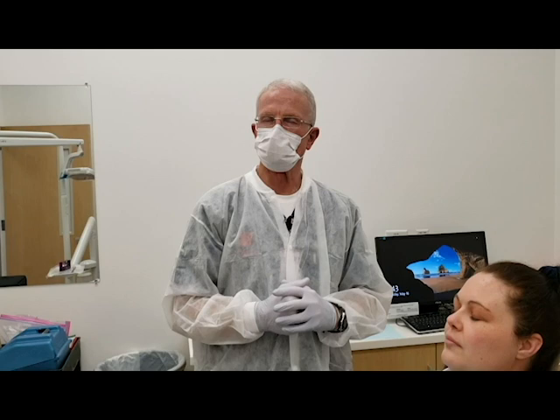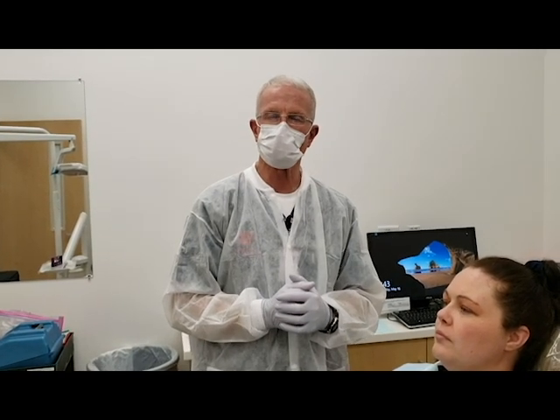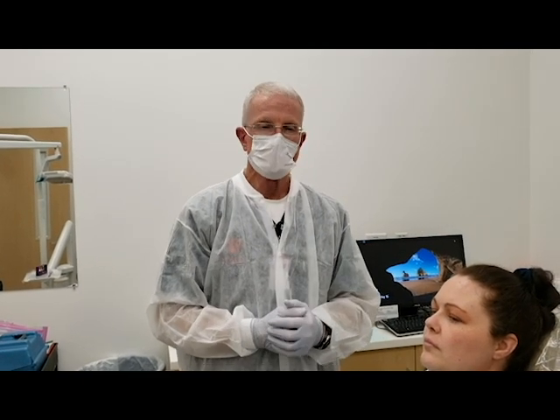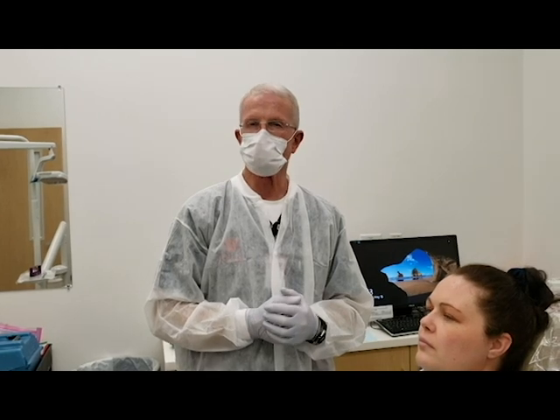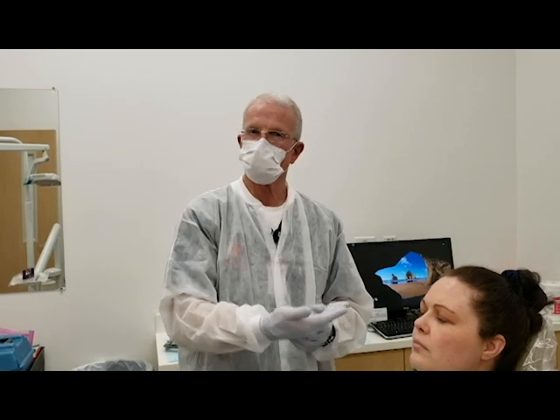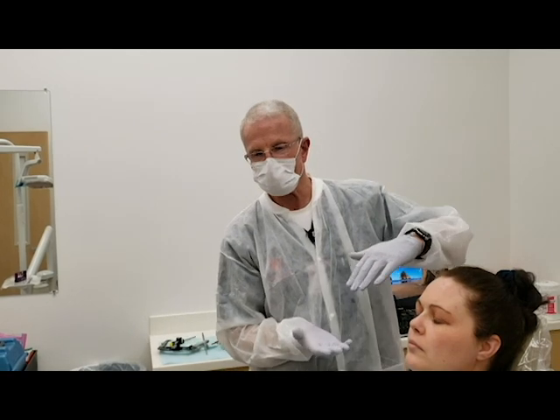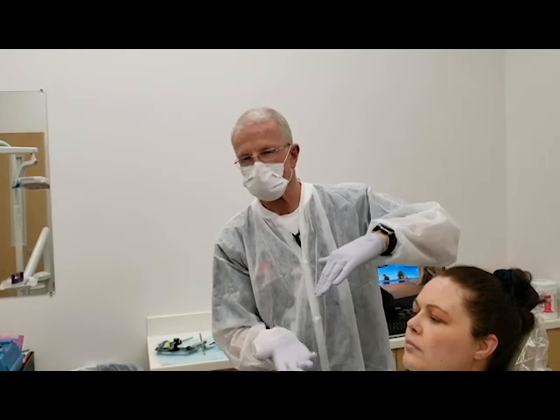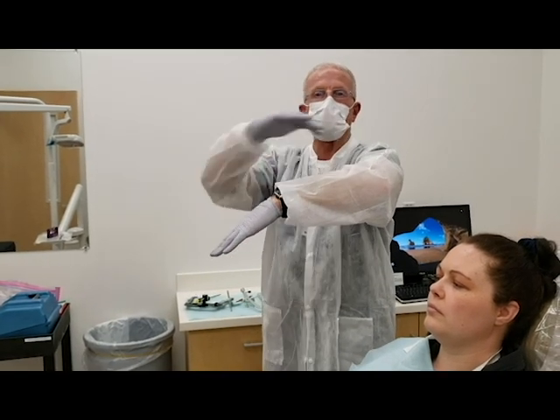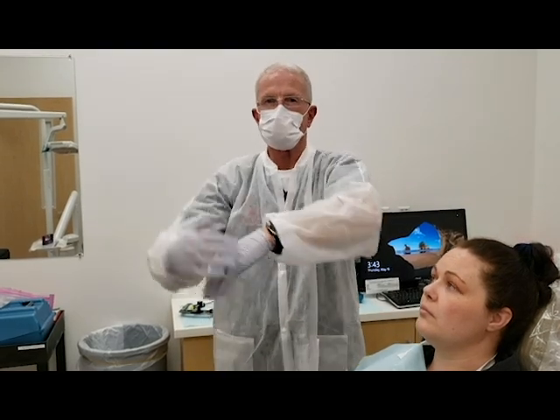One of the troubles that many students have is capturing enough of the vestibule in the anterior segment of an upper impression. This is partly because they're taught to insert the tray from back to front. As you do that and the tray is being inserted, it literally has to go around those incisors and come up underneath the upper lip. So it's defying the laws of physics to get the material up and into the vestibule.